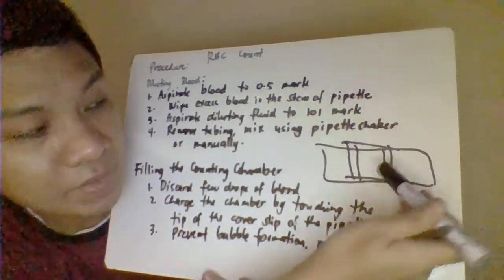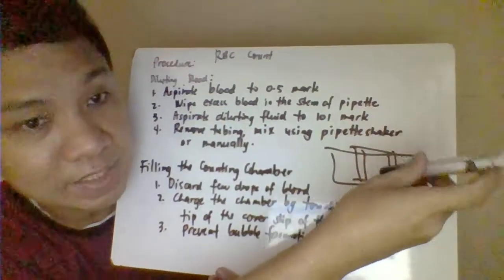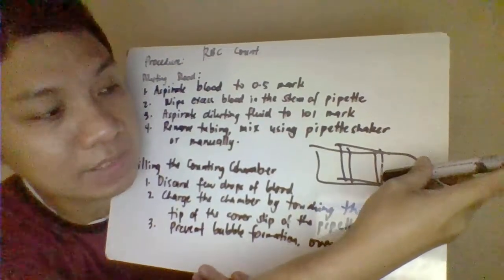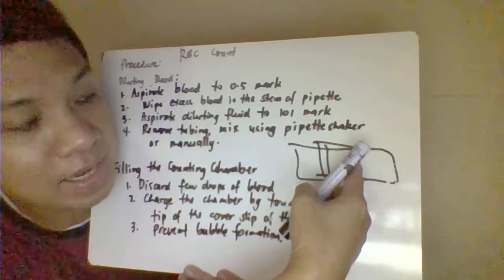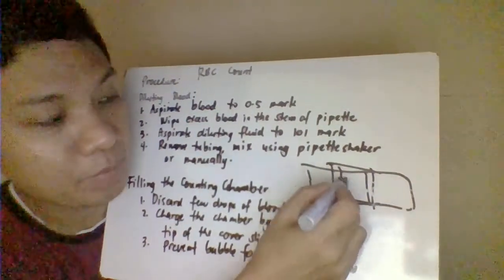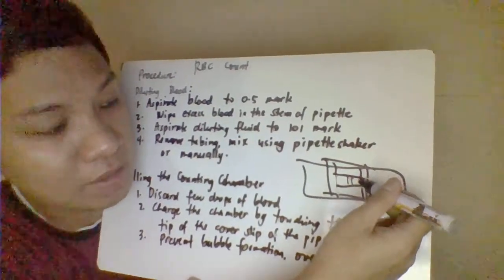Okay, kung ito ang cover slip natin, ita-touch mo lang ang tip nito. So, ganun mo dito sa end para makontrol mo, para maglabas siya ng diluted na blood. So, ita-touch mo dito slowly. Okay, then try to release that one. Try to release this one para ma-release ang ating diluted blood until you're able to cover here the entire na. Okay, so pag ganito lang siya na part, so dito tayo, ganyan. So make sure na dito lang pupunta ang ating diluted na blood.